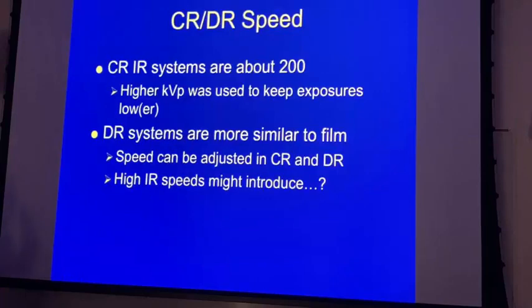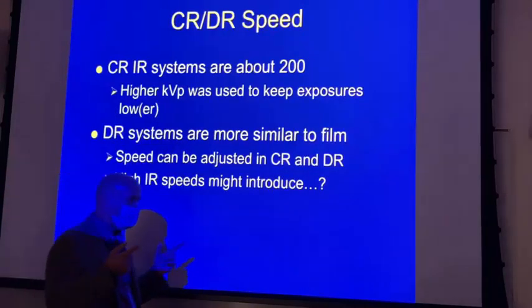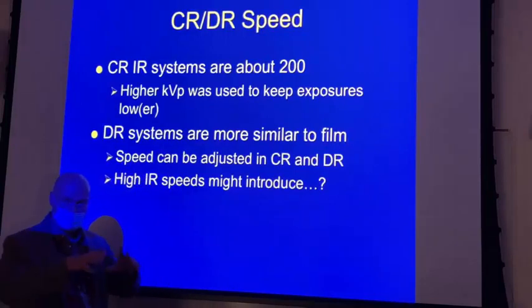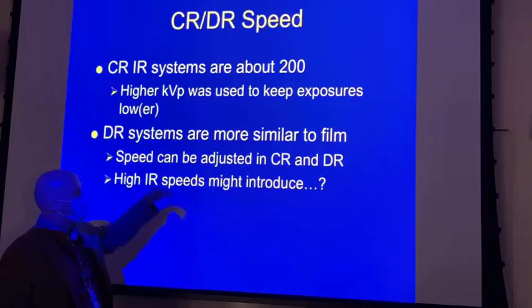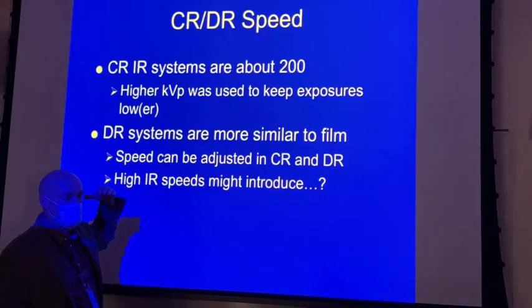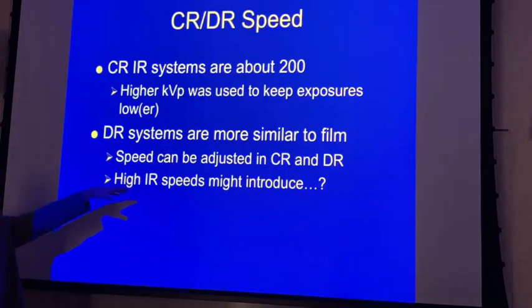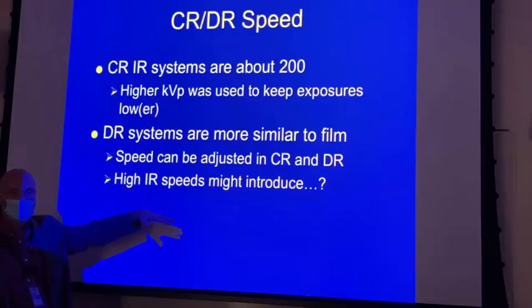It just took a while to get there. CR made it go up, and then with the hopes that with a reduced repeat rate, it would go down as a population. But once we got to DR, and I really think this is part of the reason why Medicare and Medicaid are really putting their foot down on conversion to DR.